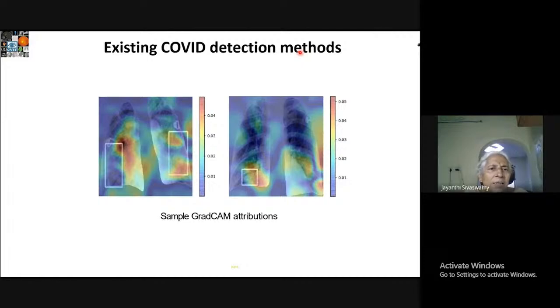First of all, there's hardly any overlap, very little overlap. The radiologist says this entire region is bad. Here there is a reasonable agreement, whereas here it is not. But that is really not the main thing. If you look at the chest X-ray, the lungs are here, whereas it is giving some bad regions outside the lungs, even here.